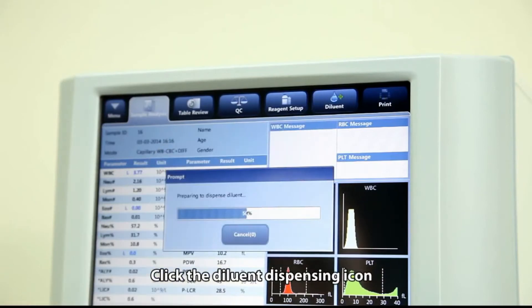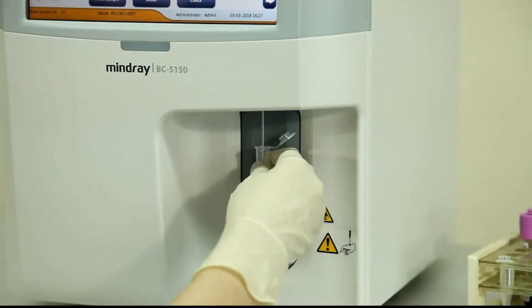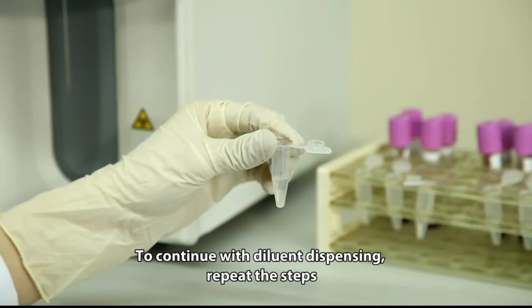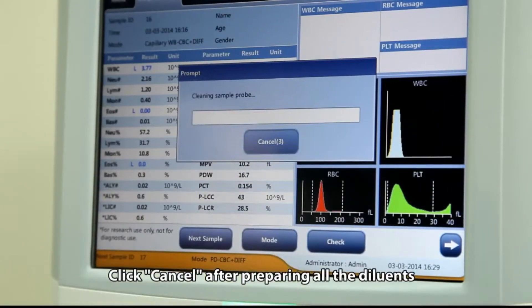Click the diluent dispensing icon, then present a clean tube to the sample probe. Press the aspirate key to dispense 480 microliters of diluent. To continue with diluent dispensing, repeat the steps. Click cancel after preparing all the diluents.